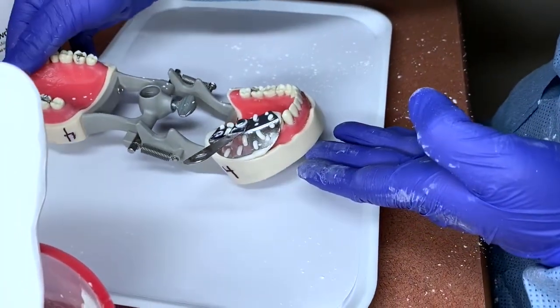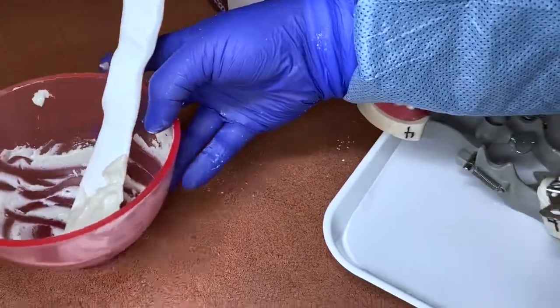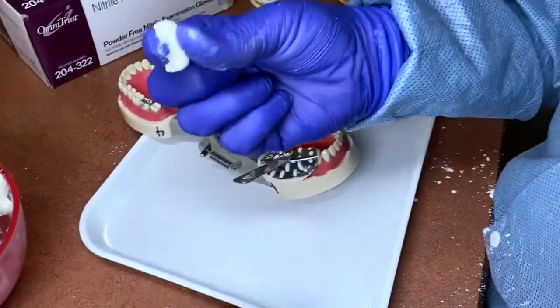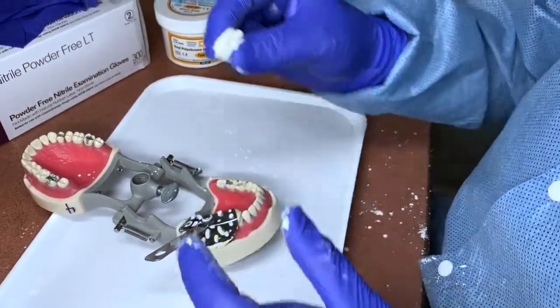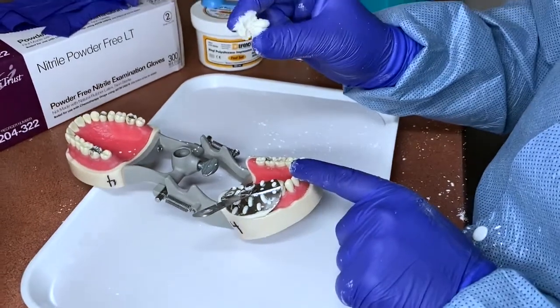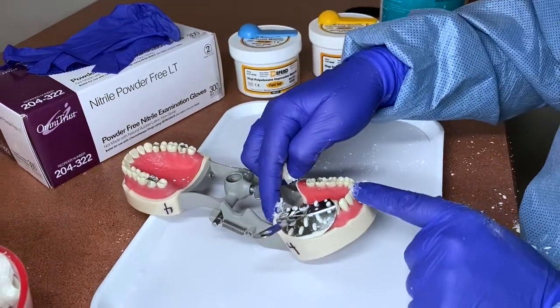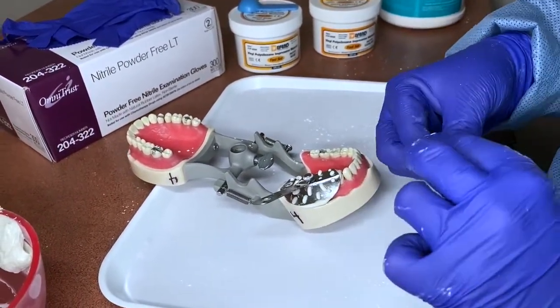Wait for the alginate to set up. There's usually some excess alginate left in the bowl — you can hold it in your fingers to monitor when it sets, so you know when to take the tray out. Keep in mind we're using a typodont, but in a patient's mouth the heat and saliva cause it to set more quickly. Each alginate also has different setting times — fast set or regular set — so read the manufacturer's directions for working time.